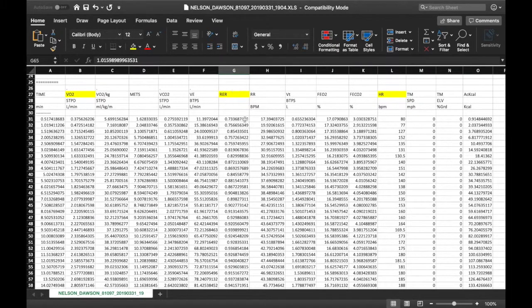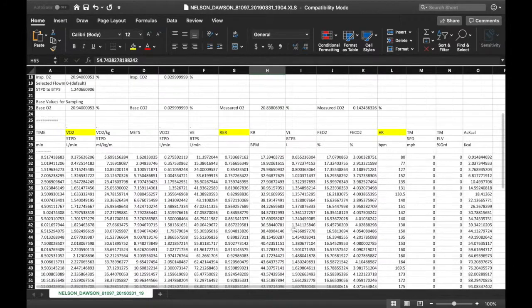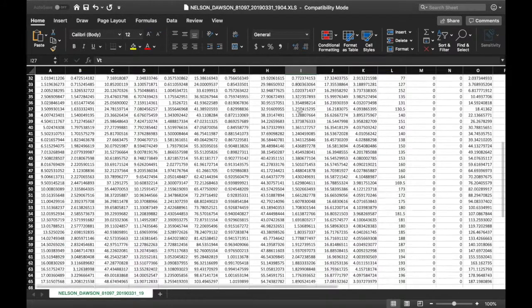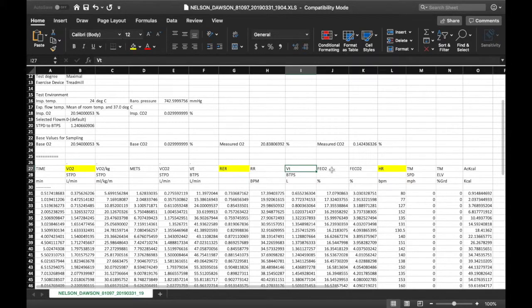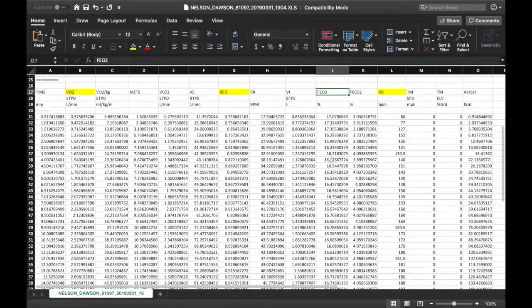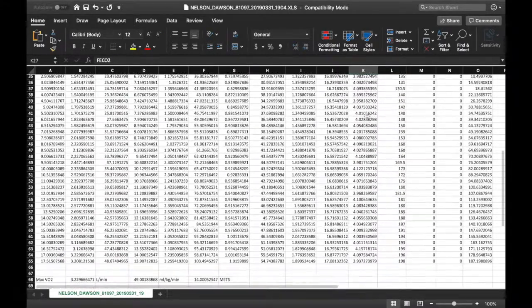RER is another big one to look at. Next is respiratory rate in breaths per minute — as he gets working out harder, he's breathing a lot more. VT is tidal volume, and then there's the percent of oxygen and the percent of CO2 that's breathed out from the client.